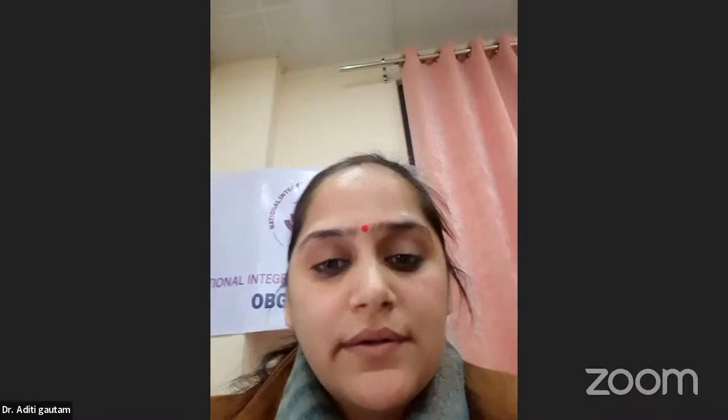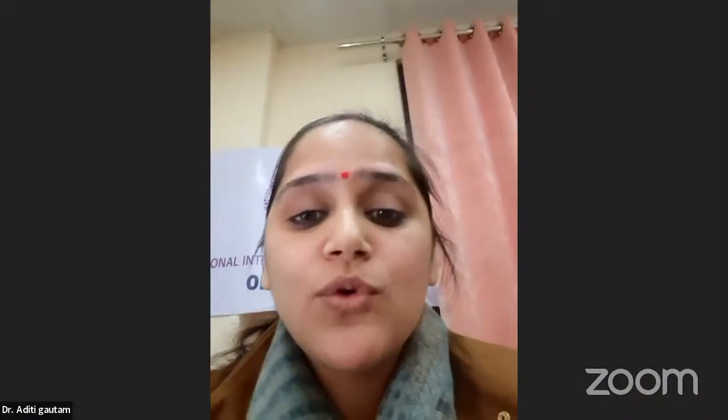So, carbon dioxide. Yes, sir. I want to ask, can room air cause embolism? One thing I am telling you, this carbon dioxide should be taken from an authentic source. Otherwise, there is commercial carbon dioxide used in making cookies and bakery, which is not medical carbon dioxide, and that is impure carbon dioxide. This can harm the patient and can also harm the surgeons. We are there in the operation theater, this carbon dioxide comes into the atmosphere, the surgeon inhales this impure carbon dioxide, and it will produce harm. So be careful, always purchase medical carbon dioxide from an authentic source.